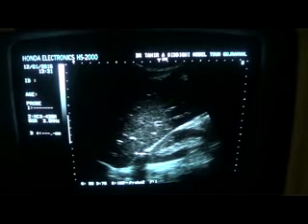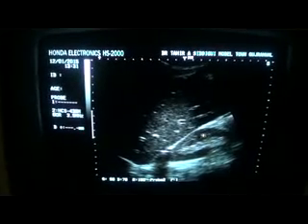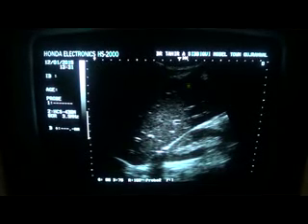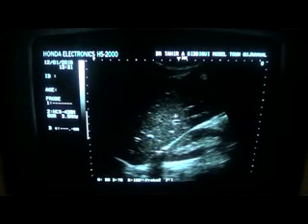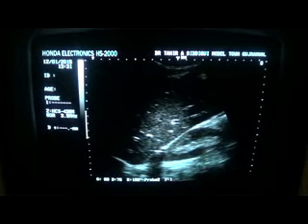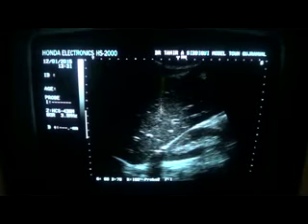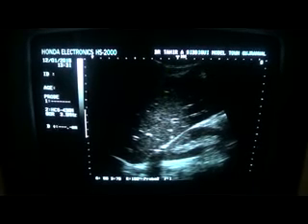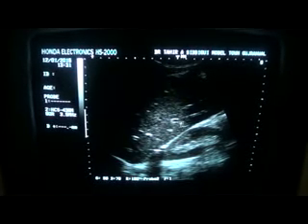Because the echogenicity of the liver has gone down, that is the reason we are seeing the echogenicity of the renal parenchyma being globally and diffusely raised. When sound waves travel and strike the renal parenchyma and return, they travel through this type of congestive, toxic liver — in which bacteria are producing exudates and there is fluid within it — and the sound waves travel with more speed through this type of liver as compared to normal liver parenchyma.